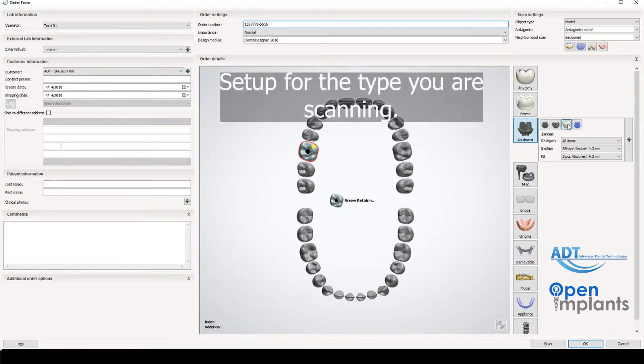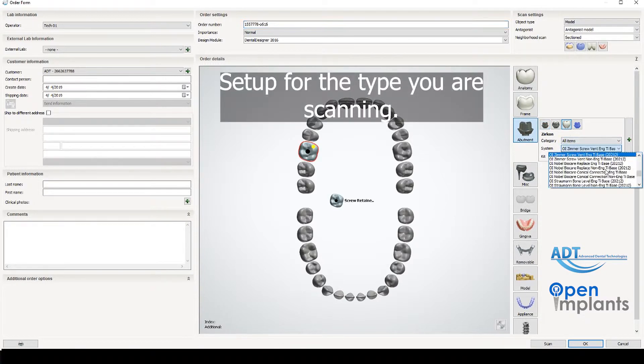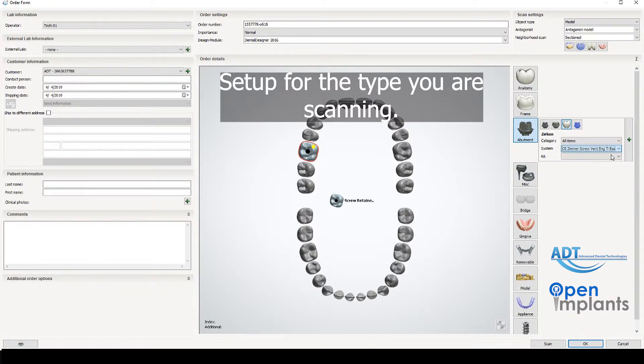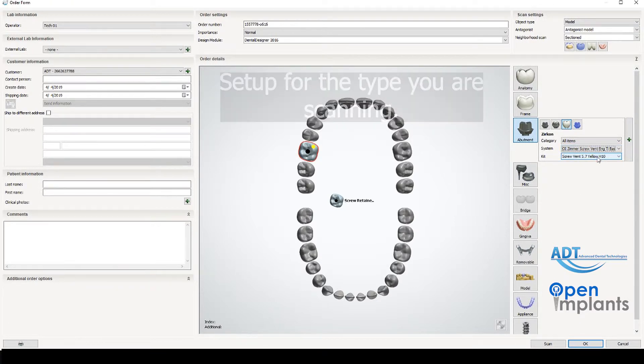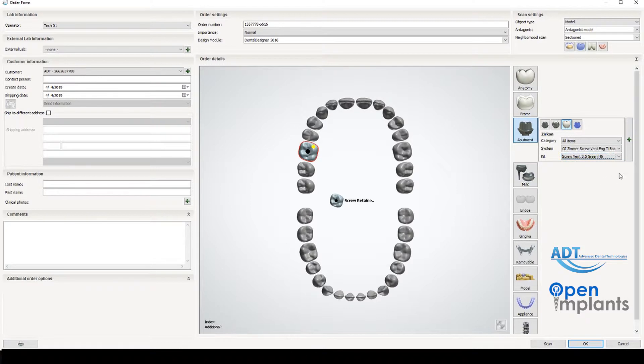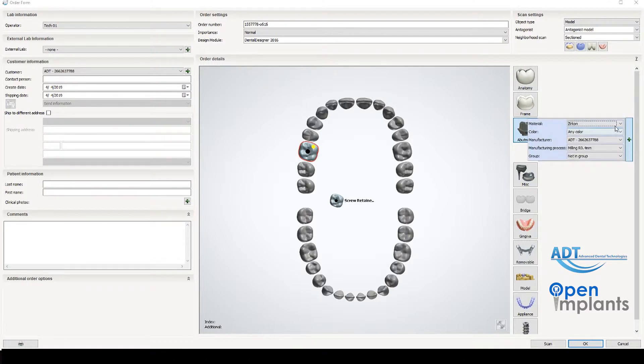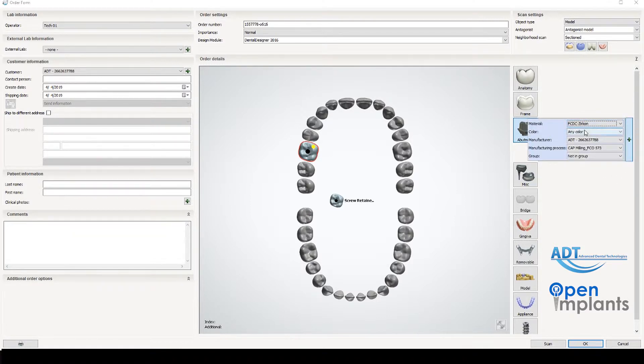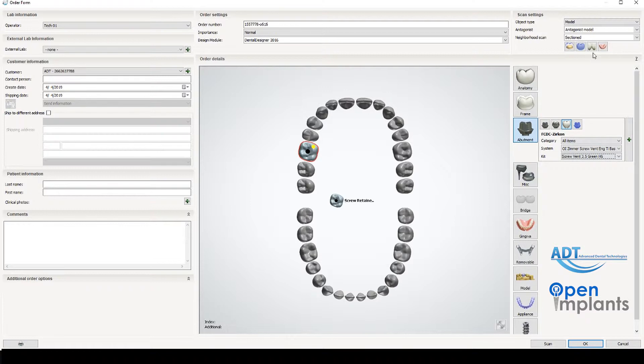Then we select the correct system we are using. We are doing a Zimmer so I select OI Zimmer screw vent. Then we select the kit or size that we're doing and we are doing a 3.5 so that's what we select. We do have a gingival mask so we select this gingival scan and now we are ready to go.